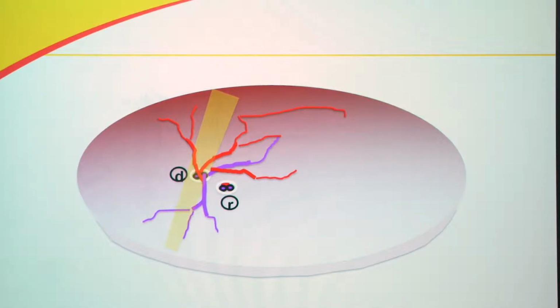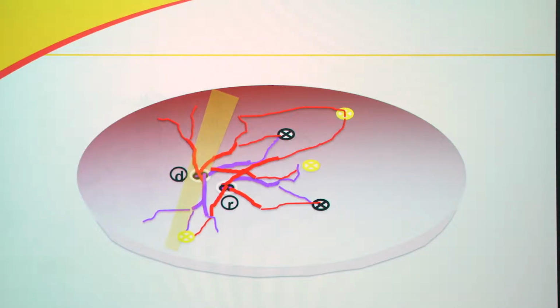However, this is a normal connection of blood vessels which supply a big cotyledon. Similarly, you see the same blood vessel distribution on the recipient side. This one on the top is an actual real TTTS connection. The one below is not. Therefore, it is very important to identify which anastomosis causes TTTS and which does not. If you burn the dots on the image marked as black, you kill the placenta and the baby. If you burn the yellow ones, you can actually treat twin-to-twin transfusion syndrome.